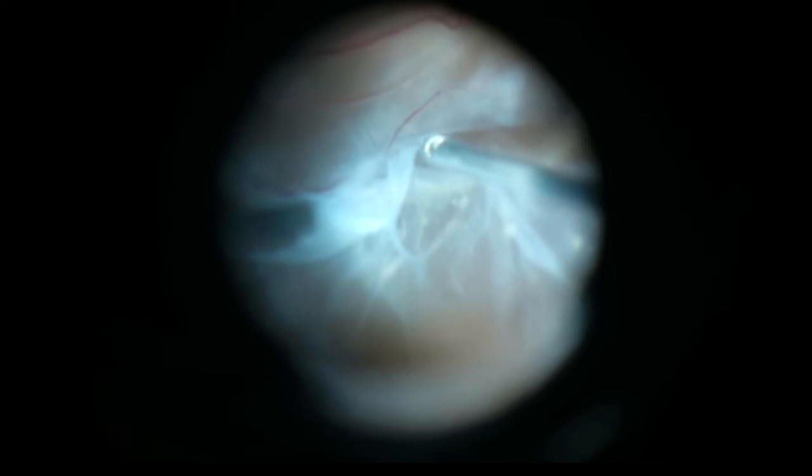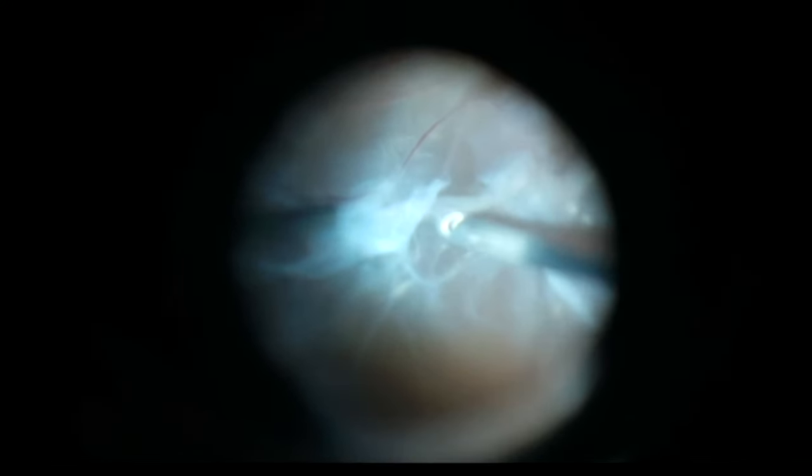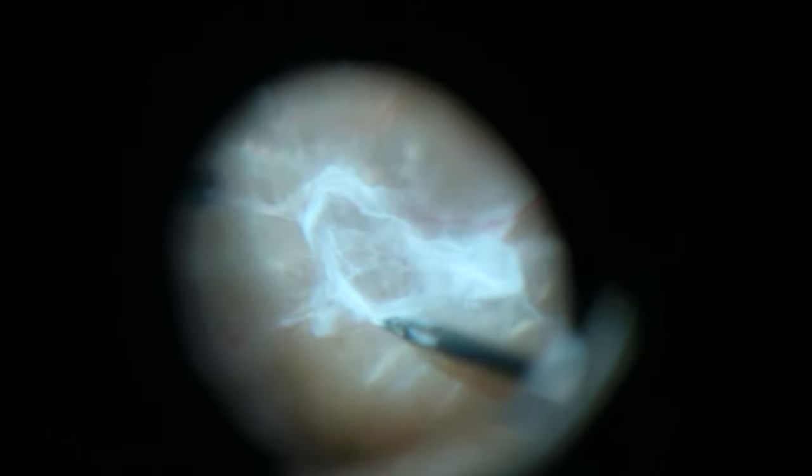I always tell people removing scar tissue from the retina is a lot like removing a label from a bottle. It's difficult to tell until you start to peel it how hard it's going to be to remove. Here you can see me trying to peel this plaque, but it was definitely too densely adherent.